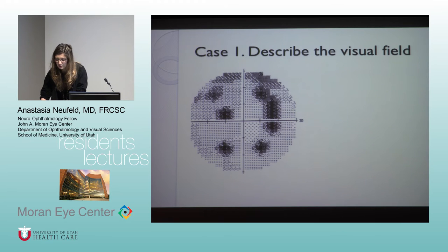Mm-hmm. So does anybody recognize, kind of pattern recognition, what this field is? So let's start with categories. Is it brain? Nerve, it looks retinal.